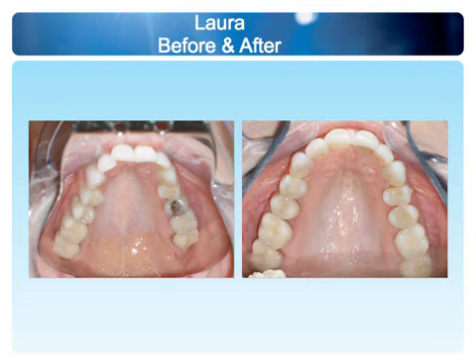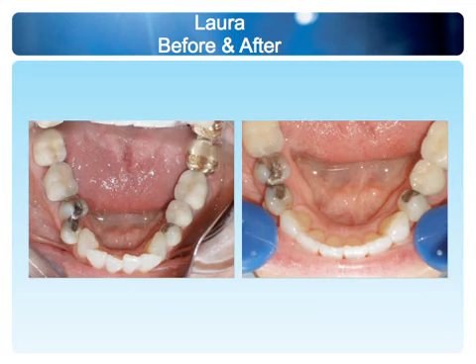Getting that V-shaped arch to a nice Roman arch. So we went from Gothic to Roman, using Invisalign. And the patient let me change a filling too. Obviously that became a nice shape after the arch was shaped. So once we have the teeth in position like this, the lower should follow. And there is a big difference in how posteriors are upright versus leaning in over here. So, from leaning in completely, poor buccolingual inclination, to appropriate buccolingual inclination.